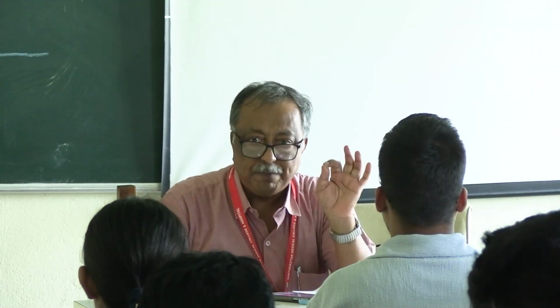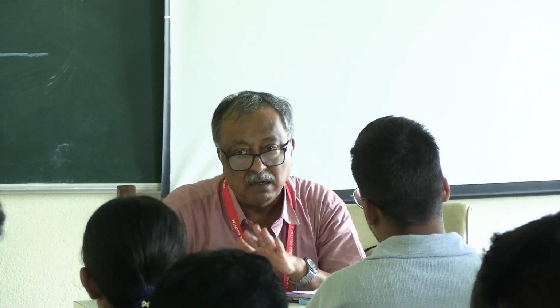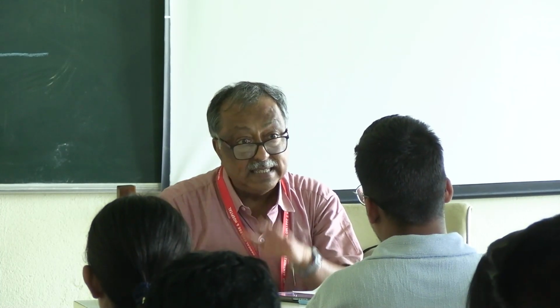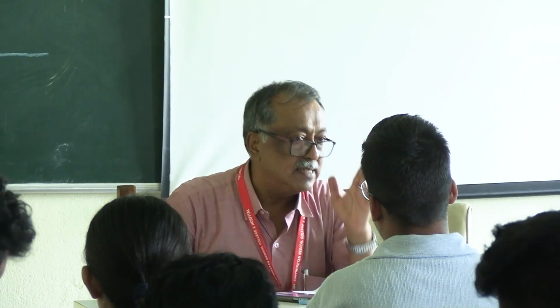And what is the whisper? Whisper is, again, defined. It is the sound produced by the residual volume of the lung. Everything is clearly defined. Otherwise, you cannot assess.